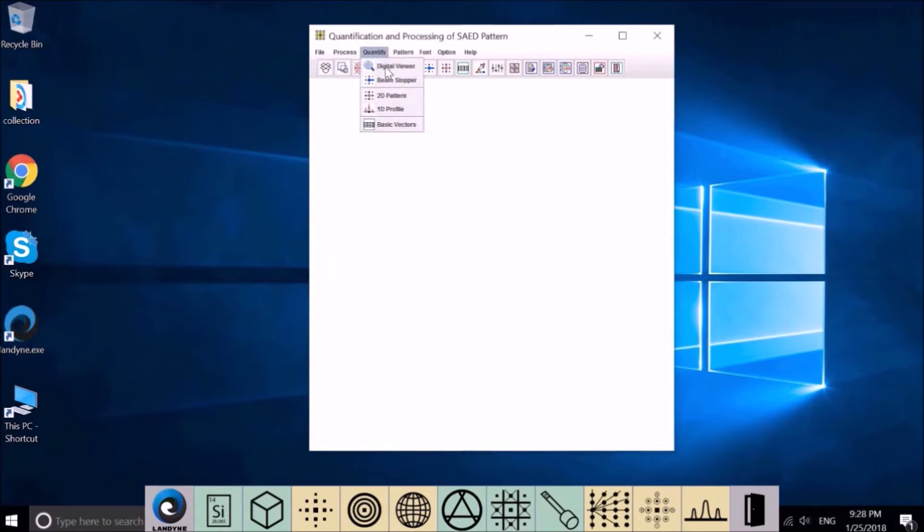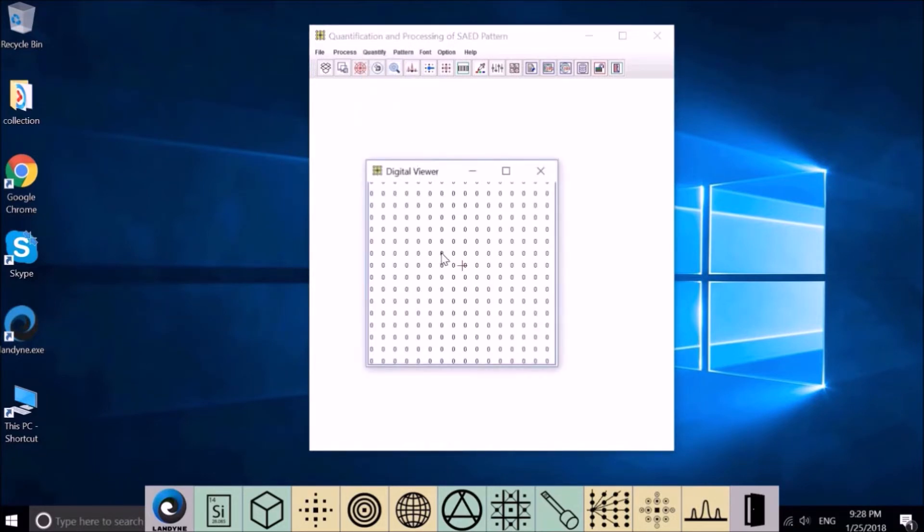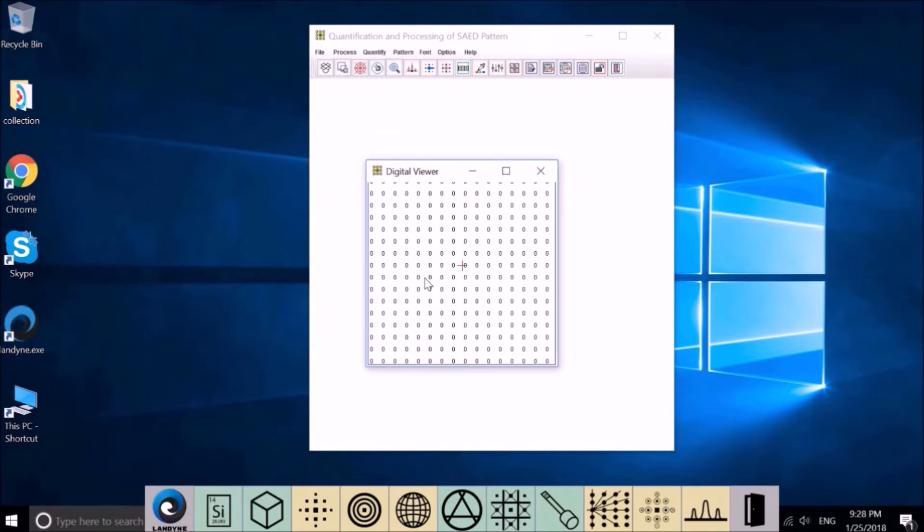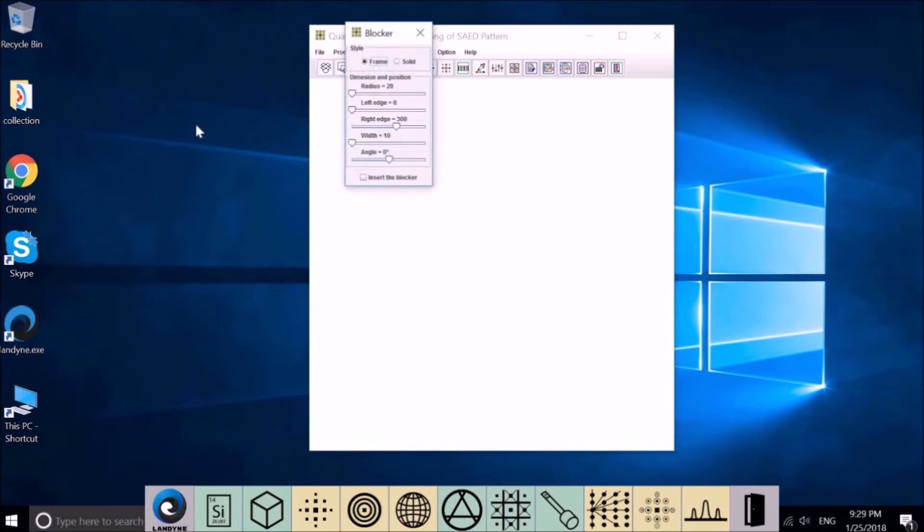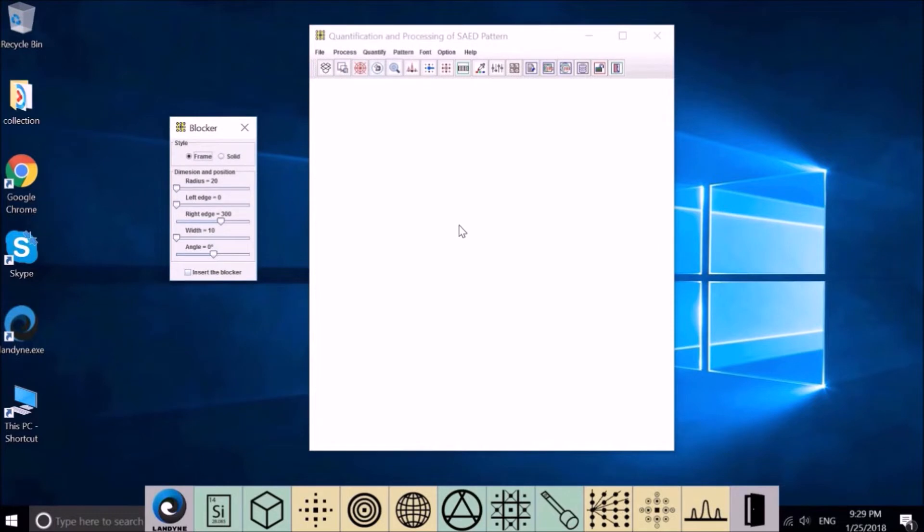Quantify. The first one is a digital viewer. If there is intensity here, this will show the actual density distribution. Beam stopper - if your diffraction pattern has a beam stopper, we will use this one to simulate the situation.